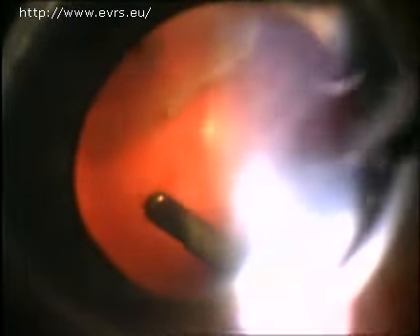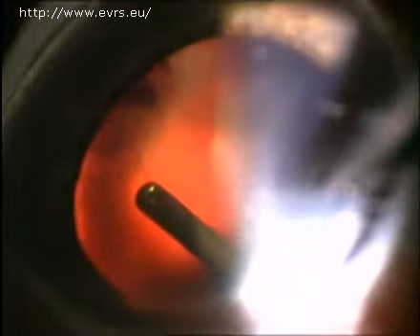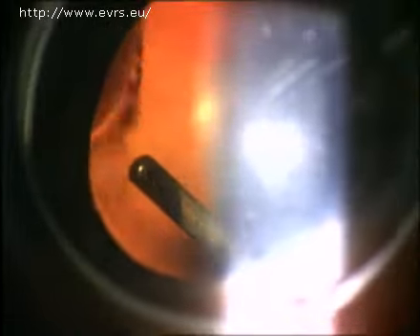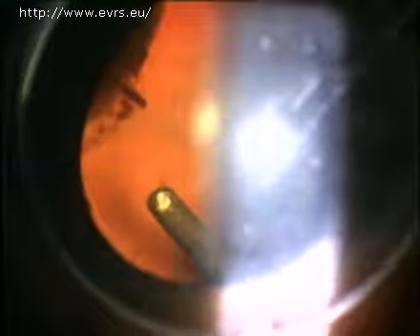We do not pick a vitrectomy machine like we do a vacuum cleaner, considering its power, color, and brand name. Everything we ask the vitrectomy machine to do is so vital to the final result that we can't possibly be satisfied by a machine that only nearly achieves our goal.